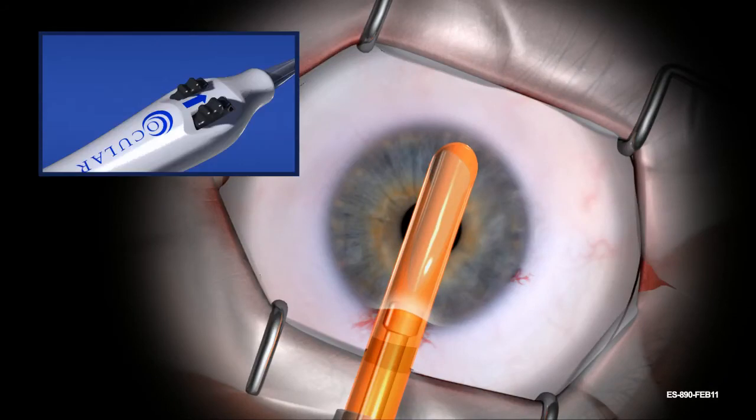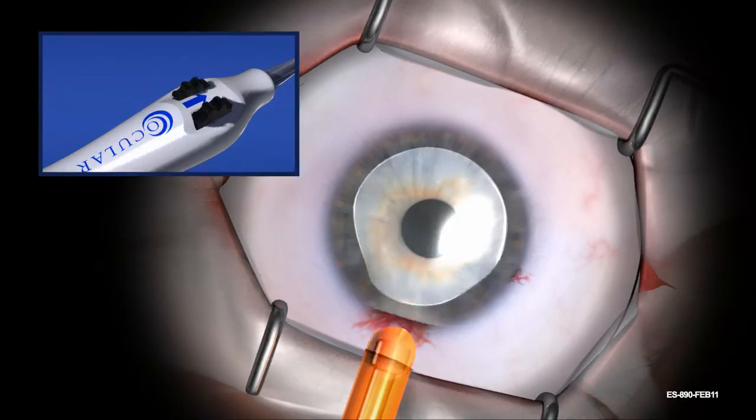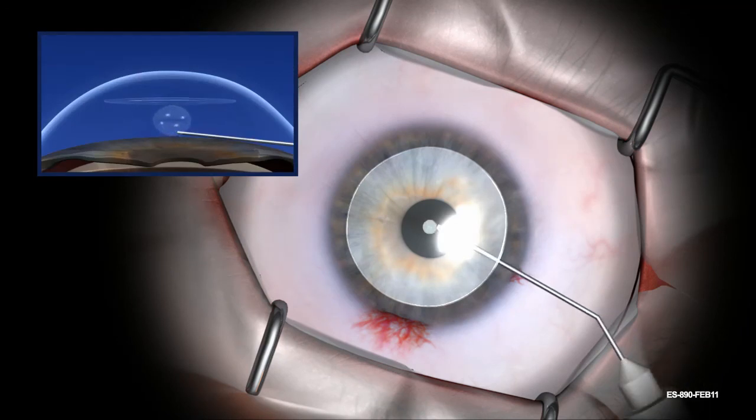Deploy the allograft by rotating the black deployment wheels toward the patient. Move the black deployment wheels until the allograft is completely uncovered. The Endosurter uncovers the tissue allograft; the sheath will retract toward the incision during deployment. Hold the device in position as the allograft deploys. After the allograft has deployed, hold the black deployment wheels in their position and remove the device from the anterior chamber. Discard the Endosurter after use.